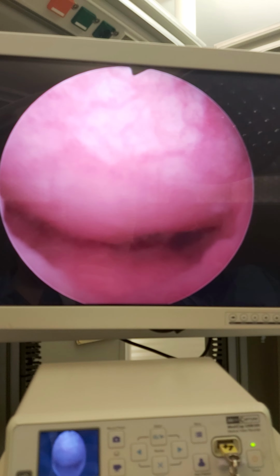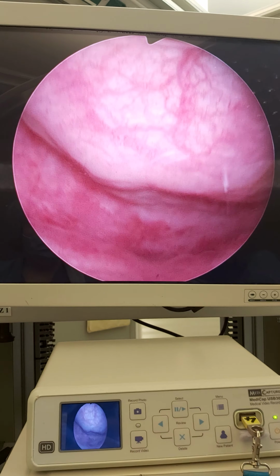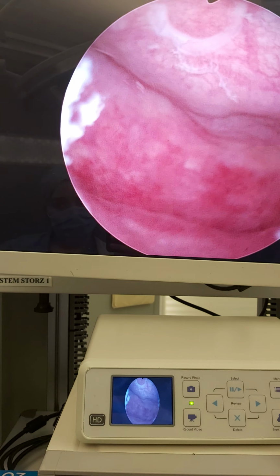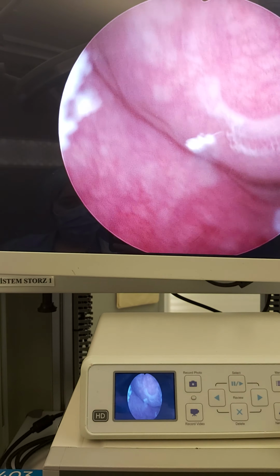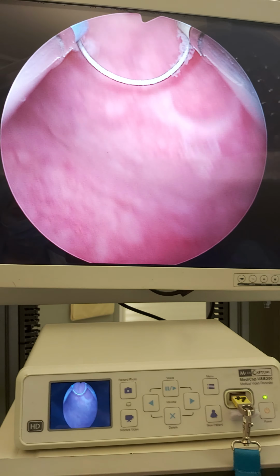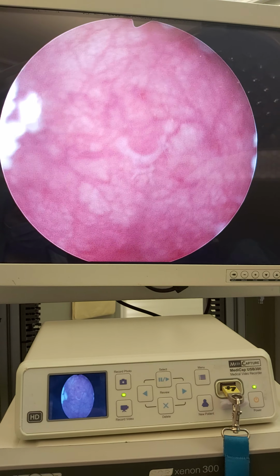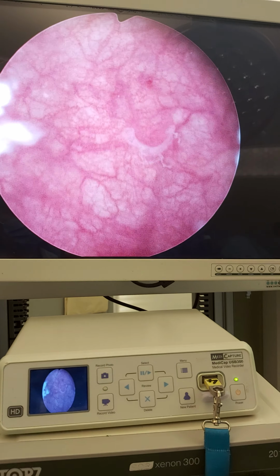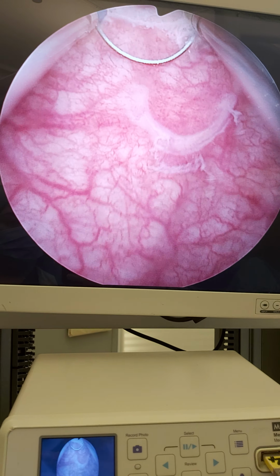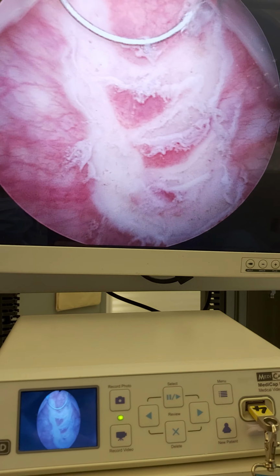Okay, now the bladder is closed. I am filling it now. This part is the Trigon, and this part is the part which is coming into contact with the bladder Trigon. So I will see now, yes, look at this. There is an inflamed reddish area. Yeah, when we look from a distance, I can say there's inflammation. I am fulgurating this part to let some new tissue formation.